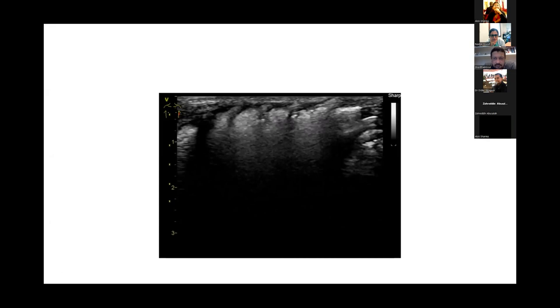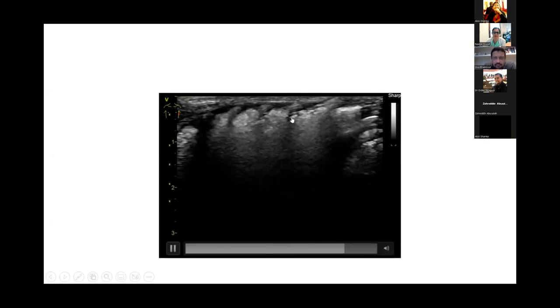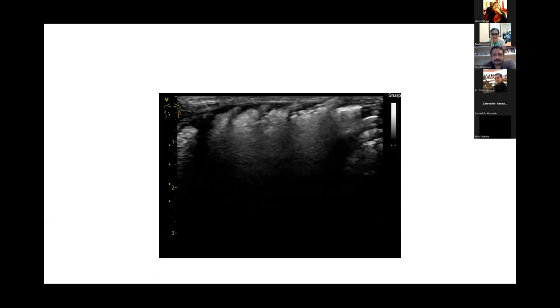Yeah, there are some tiny bronchograms indeed. But I think, maybe on the left side, maybe further to my left of the screen. Impossible to say. They're tiny, tiny. These are microconsolidations with a scan that is not completely vertical or at least perpendicular, which means that we're seeing a more rounded effect of the pleura instead of a line. And then we will see more of these tiny little microconsolidations. So I don't know. I don't think so.